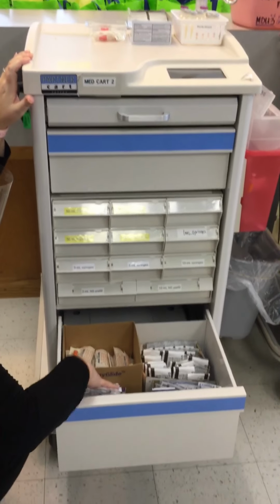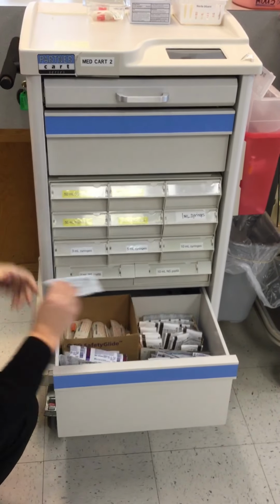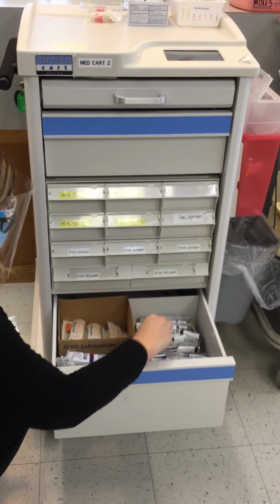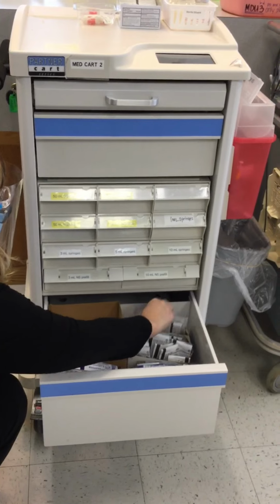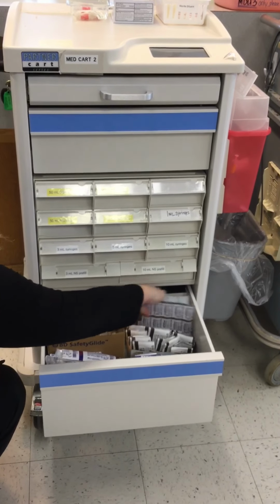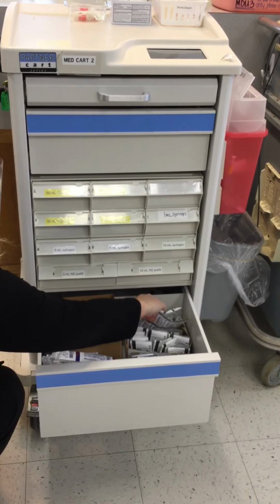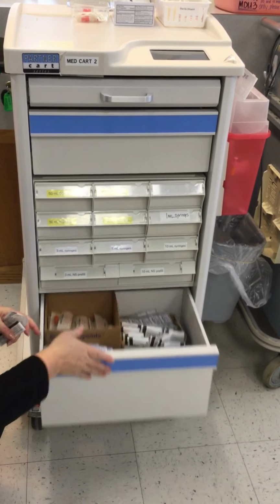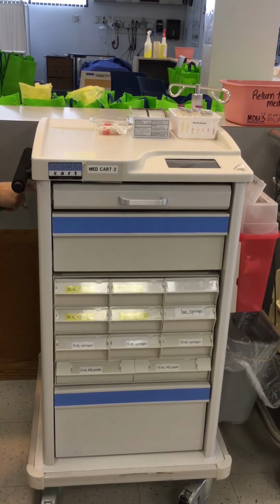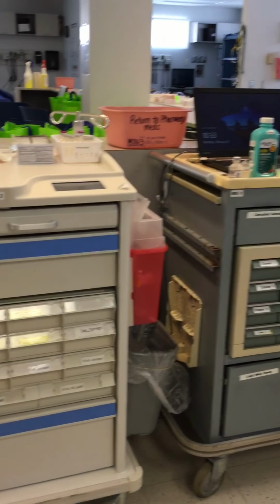Okay, and I'm going to grab the syringe that I need with an extra needle so we can change the needle. Anything I'm taking out of the cart, I'm going to make sure I relock it when I get ready to go.